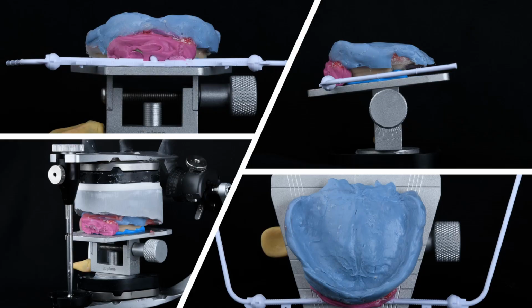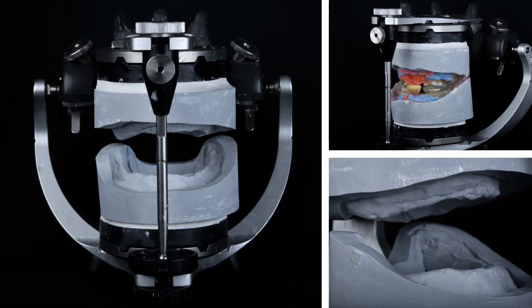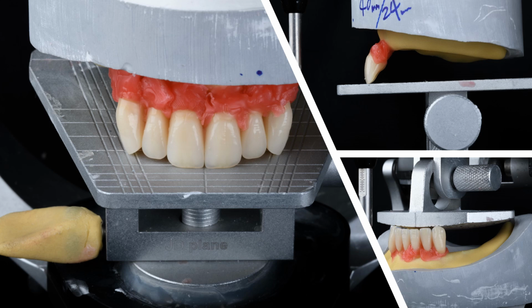With this information, the lab can accurately mount and align the artificial teeth. In the lab, technicians can use the face bow to confirm the midline and lip positions. These reference points allow for precise mounting with the maxillary and mandibular anterior teeth aligned based on the face bow markers. We can do average mounting and artificial teeth arrangement based on the average artificial teeth arrangement.